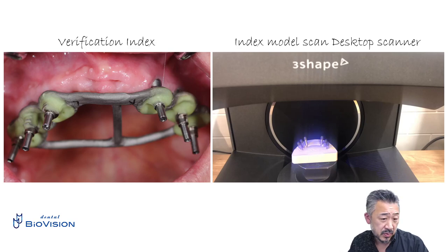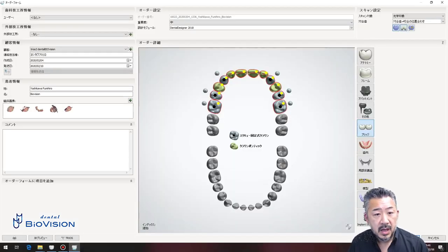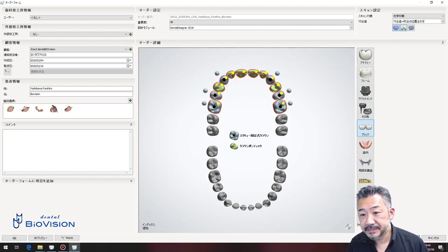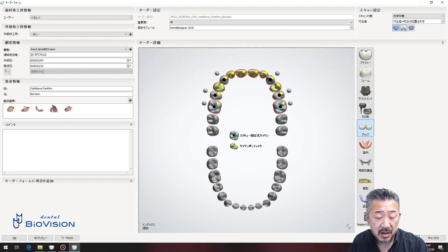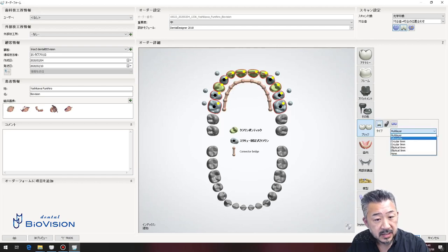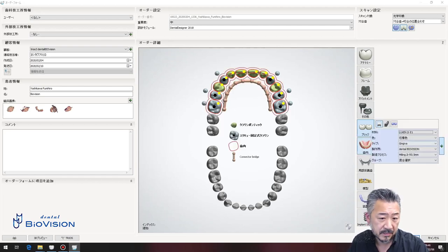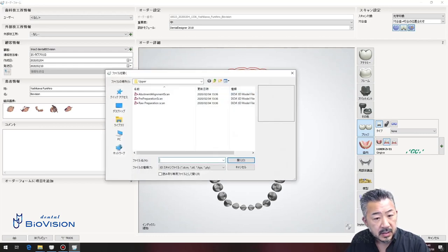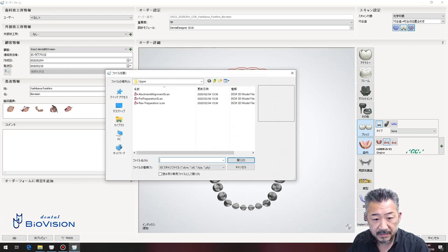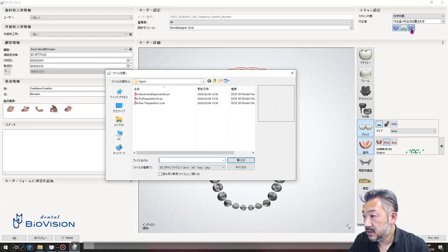This step is very important — this part is difficult to explain. Make an order form with the 3Shape Dental System to design the implant parts. Select 'screw-fixed crown,' then select 'crown pontic,' then select 'connector bridge' to connect everything. Then select the gingiva in the gingiva module to add the gingiva part. When you select 'Add Scan' in the upper right, you can see it here.